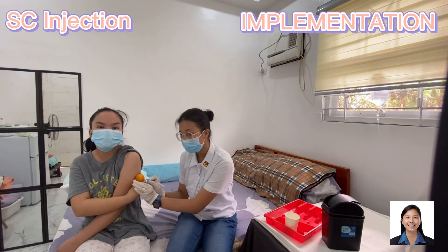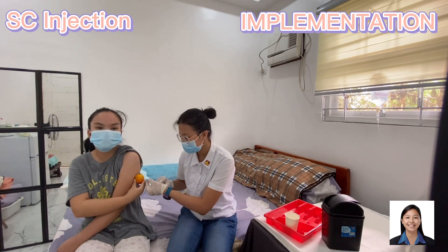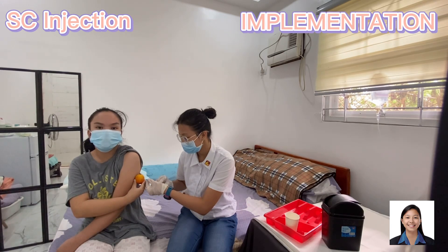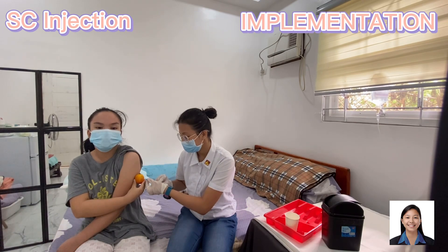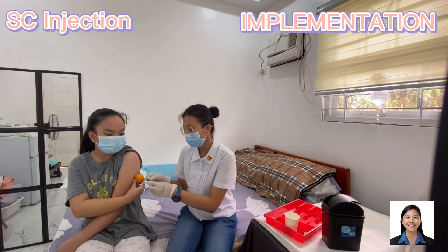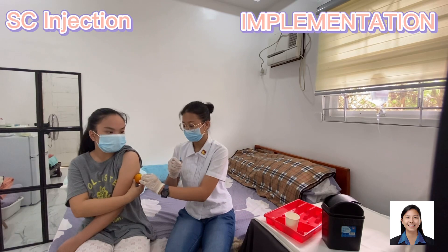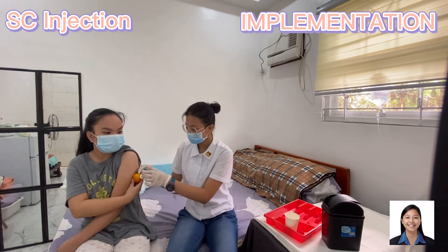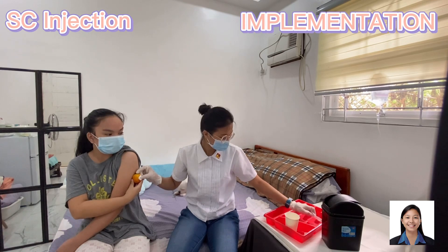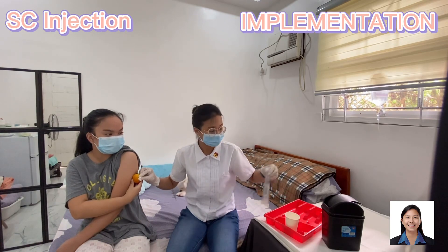With your non-dominant hand, stabilize the hub. Then inject the medicine slowly and steadily. Then draw the needle out quickly. Using your dry cotton, apply gentle pressure to the site. Do not massage it. Then, using the fishing technique, discard the needle into a sharps container.